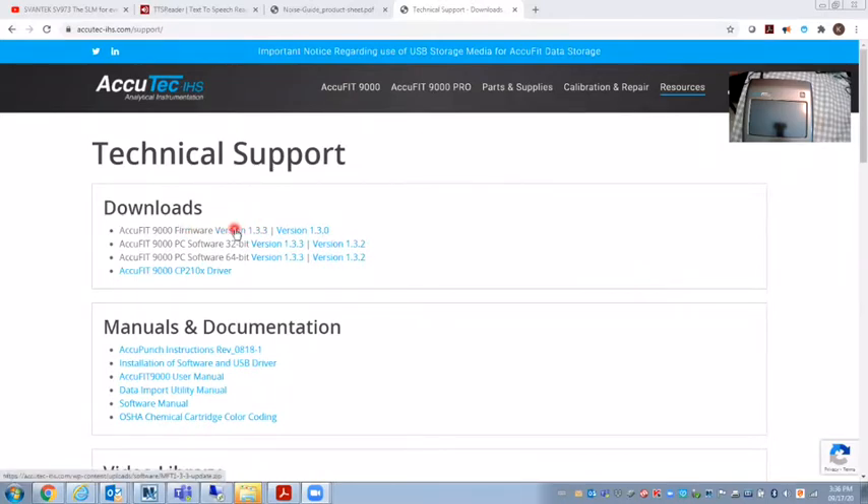You want to choose the most up-to-date version. They actually have two versions on here — this is the firmware for the software that runs the unit inside the actual AccuFit. Then there's software that should be updated on your PC for 32-bit or 64-bit Windows, and the USB driver to communicate with the unit.